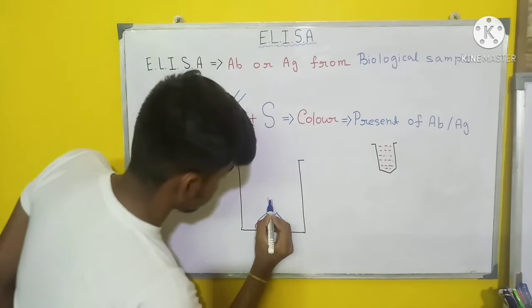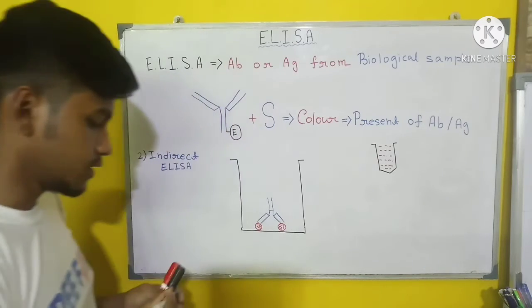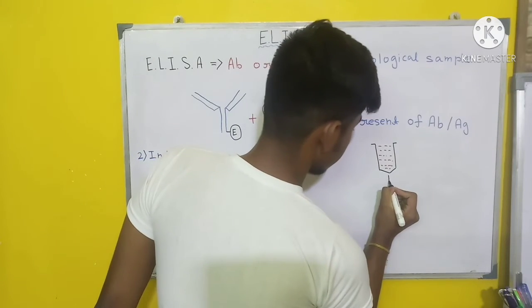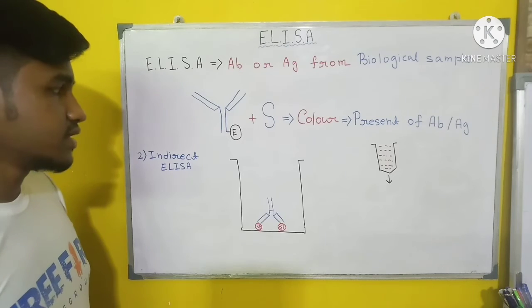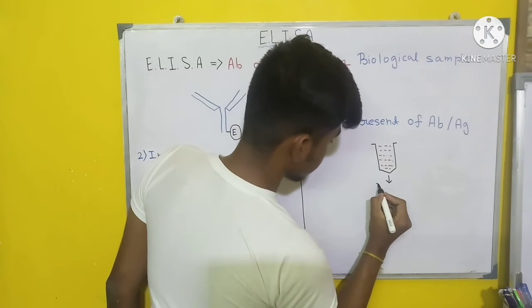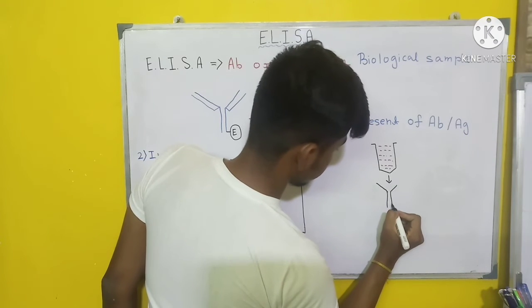And after the attachment, in the next step, we will attach our enzyme linked antibody.